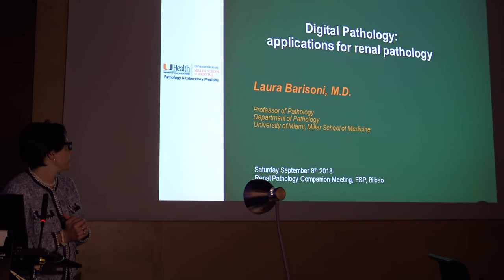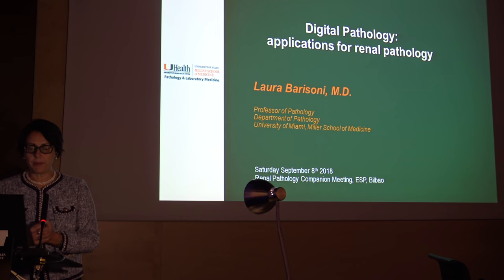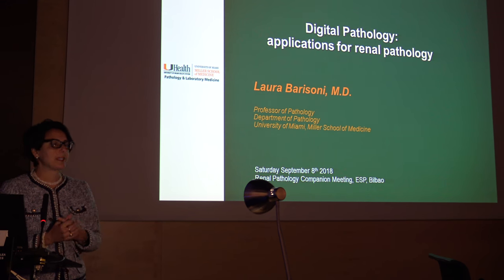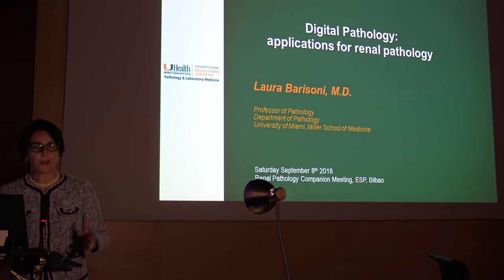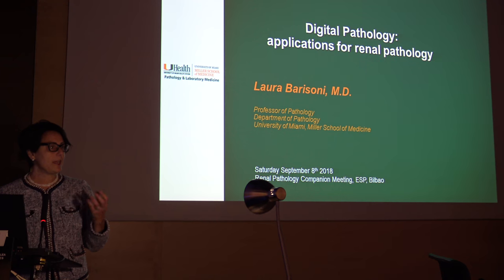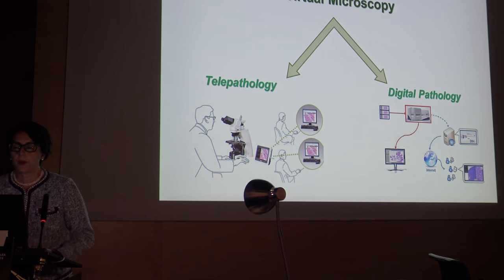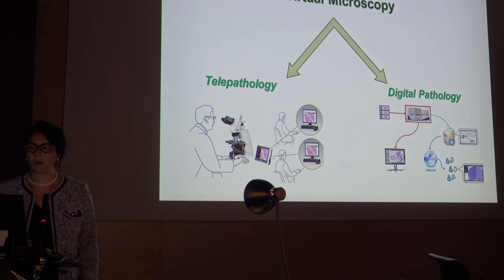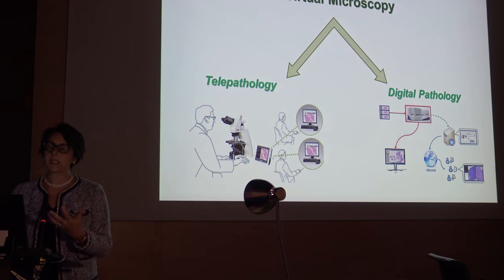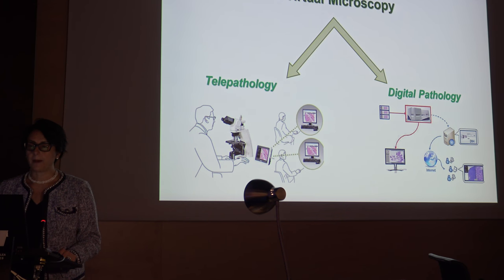I want to talk about something that is becoming the state of the art for what we do in pathology: what has been done so far, which are the applications, and I want to take you a little bit to the future, how we can look to the future using this technology and what we can do today to reach that goal. When we talk about digital pathology, we talk about glass slides that are scanned into whole slide images and stored in a digital pathology repository. Digital pathology is part of virtual microscopy together with telepathology. Differently from digital pathology, telepathology is the transmission of an image that can be viewed at a remote site.